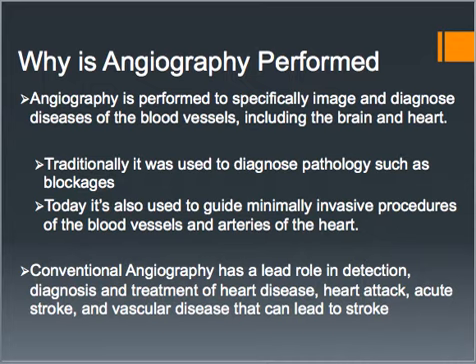But more recently, I mean, not super recently, but within the past decades, radiologists and cardiologists and vascular surgeons started using X-ray angiography procedures to guide minimally invasive surgeries of the blood vessels and arteries of the heart. This became huge. I mean, instead of having that patient have to undergo a major surgery, we could do something very minimally invasive and either diagnose or treat the patient without the cost, the expense, the danger of the surgery.